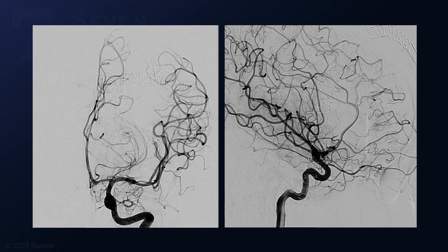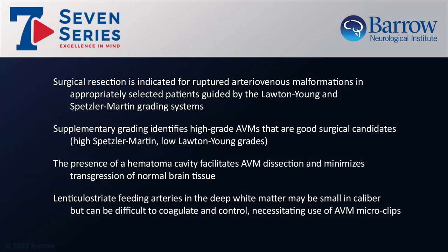Here is her postoperative angiogram. Note the preservation of her middle cerebral artery trunks and also note the preservation of the uninvolved lenticulostriate arteries. In conclusion, surgical resection is indicated for ruptured arteriovenous malformations in appropriately selected patients guided by the Lawton-Young and Spetzler-Martin grading systems. Supplementary grading identifies high-grade AVMs that are good surgical candidates — namely high Spetzler-Martin and low Lawton-Young grades in this case. The presence of a hematoma and its associated cavity facilitates AVM dissection and minimizes transgression of normal brain tissue. Lenticulostriate feeding arteries in the deep white matter may be small in caliber, but can be difficult to coagulate and control, necessitating the liberal use of AVM microclips.